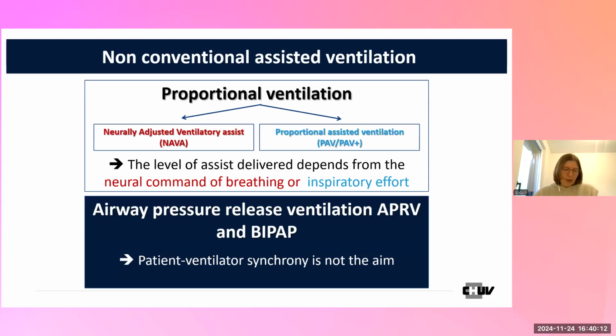Then this was about proportional assist ventilation. Now, I would like to discuss another non-conventional or special mode of assisted ventilation, which is APRV BIPAP. Here, the story is completely different. It's not proportional assist ventilation.